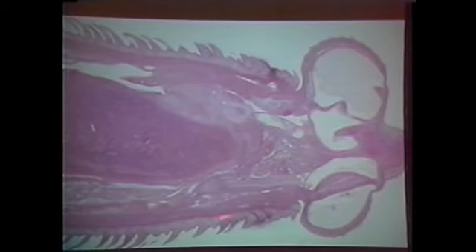And notice, when you see two sections of a nematode next to one another, don't tell your contributor, well, I see two worms. Many people do that. These things coil usually, so it's usually one worm. But if you see a section in the forelimb of an animal and the back limb of an animal, you can think maybe I have two worms. But if they're close like this, unless it's real long, this is one worm. Here, this is Gnathostoma. It has a cuticular bulb, which has little spines, but there are also spines on the body. I'm just showing you the myriad of different kinds of things. Is this a beautiful worm or what?